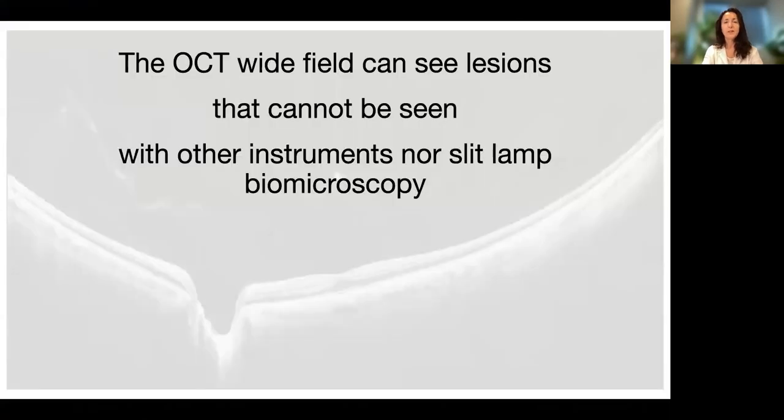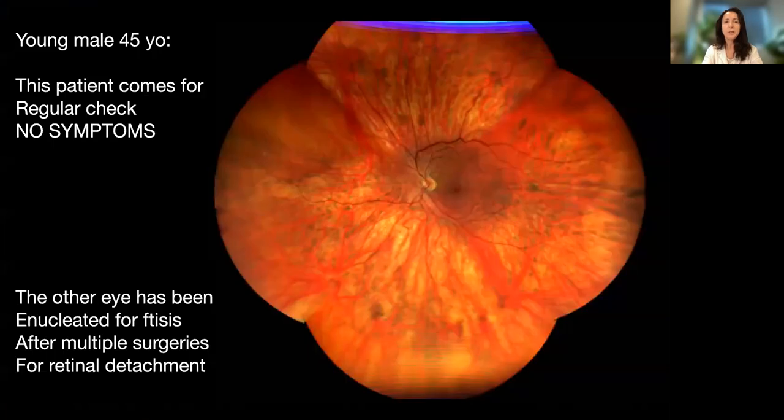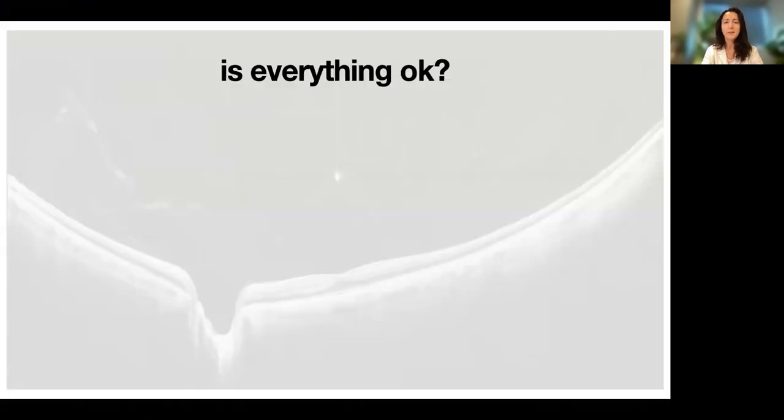The OCT wide field can see lesions that cannot be seen with other instruments. This young patient comes with no symptoms. It is just for a regular check. The other eye had been enucleated for complication of multiple surgeries.